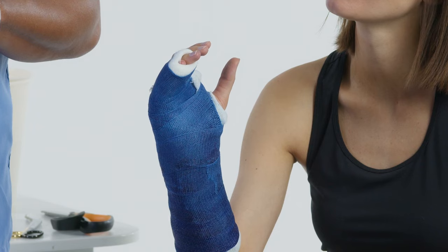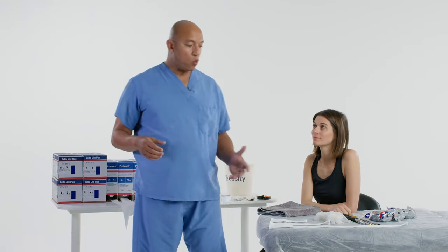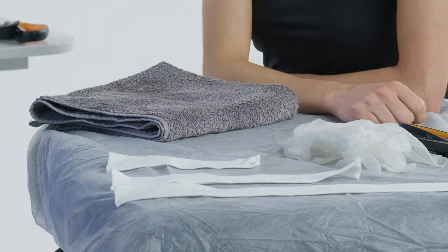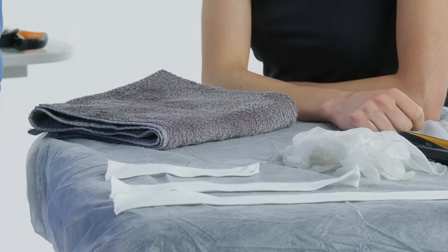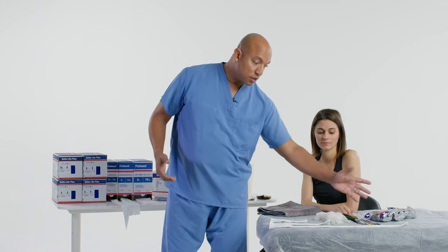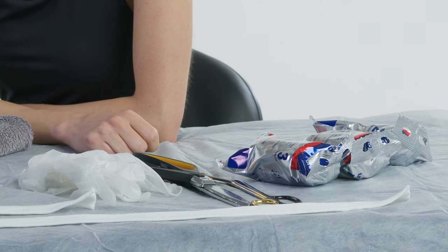Welcome to Delta Cast tutorials. Today I'm going to be doing an ulnar gutter cast, boxer cast if you will. Position is going to be important, but let's talk about supplies. We have some stockinettes already pre-cut — one for the forearm, one for the thumb, and one for the fingers. We're using a two-inch for the fingers, and cast tape which is the Delta Light Plus — a three inch and a two inch — and I'll also be using OrthoGlass Solo to involve a splint for quicker application.